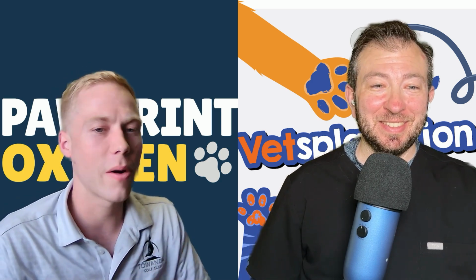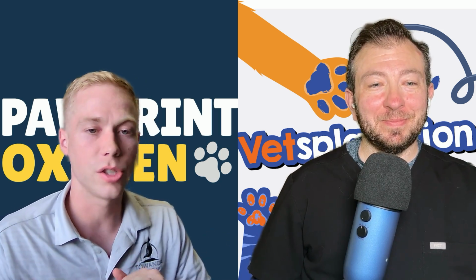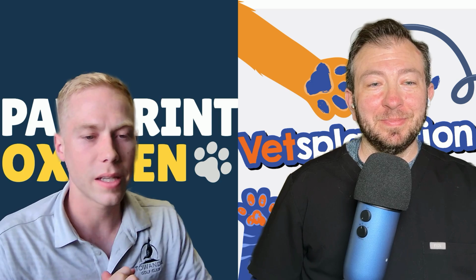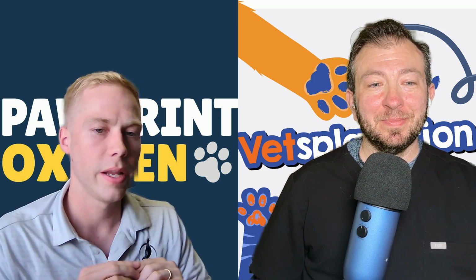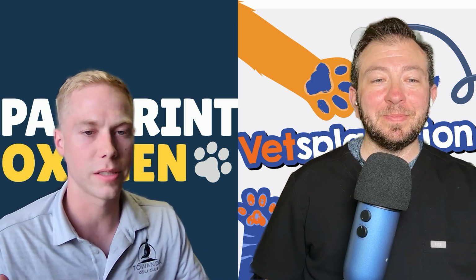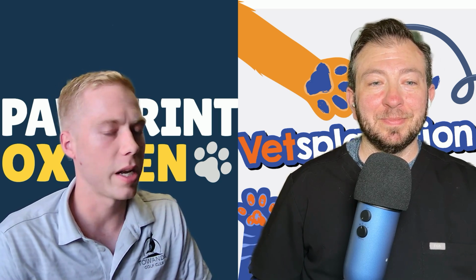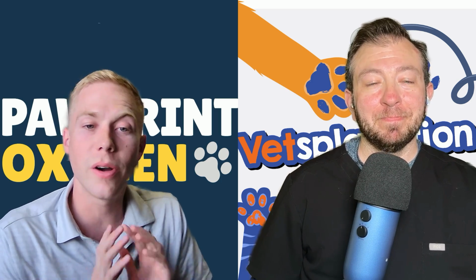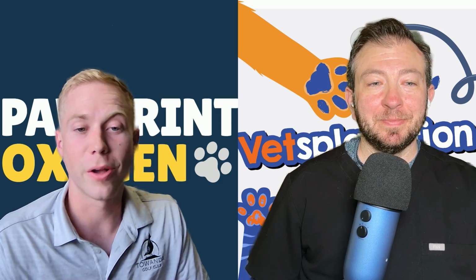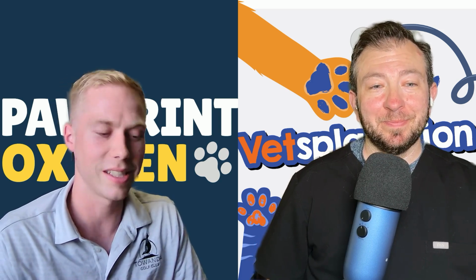So how our oxygen chamber works is it has something called a Venturi system that the oxygen goes through to get into the cage. As the oxygen goes through it, it sucks in extra room air in order to dilute the oxygen concentration, because your vet is probably going to recommend 40 to 60% oxygen in the chamber. What you don't want is 100% oxygen for that long of a duration, right? That can be dangerous in itself. You could be looking at toxicity there.